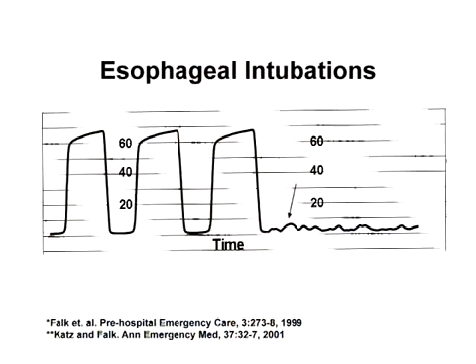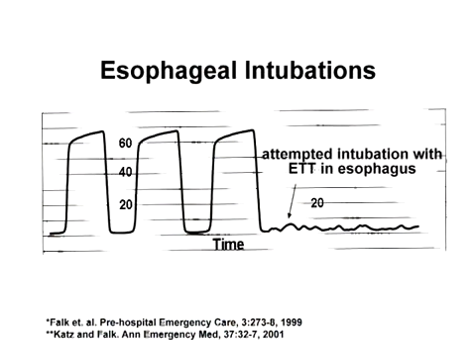There are many clinically significant events that you can detect from the CO2 waveform. If the ET tube is in the esophagus, either no CO2 is sensed or only small transient waveforms are present. Often, because you bag the patient with a bag mask resuscitator prior to intubation, there will be a small amount of CO2 in the esophagus.